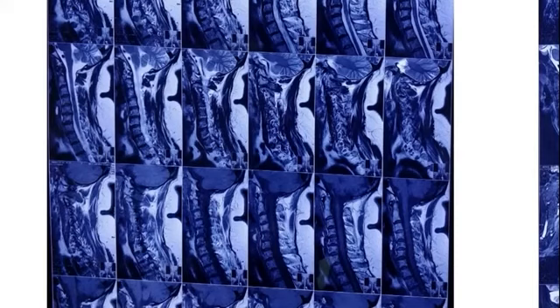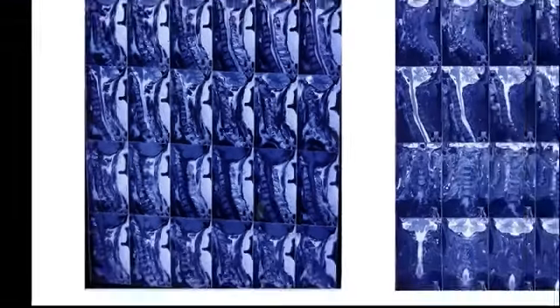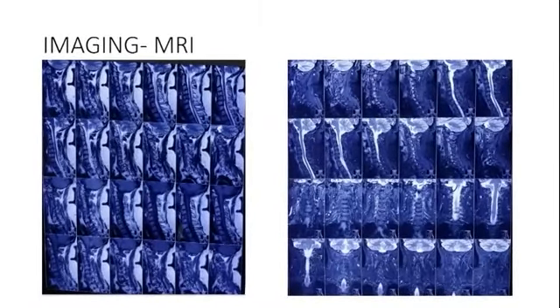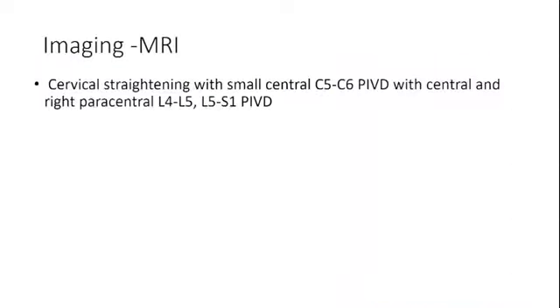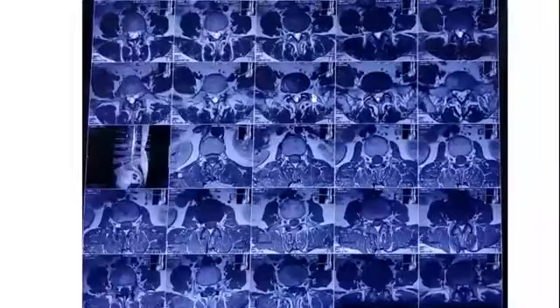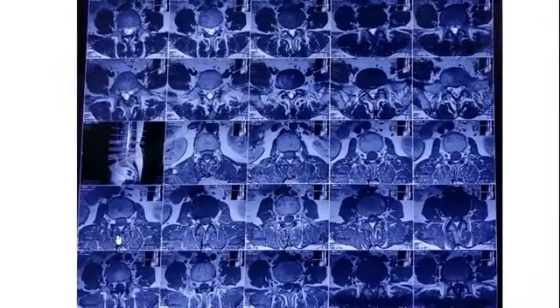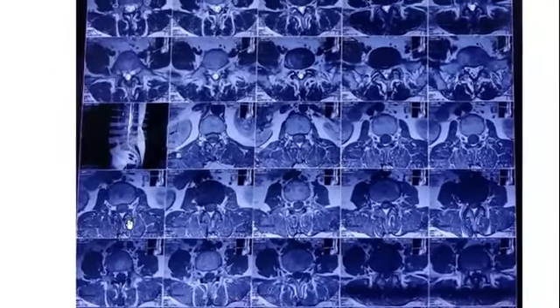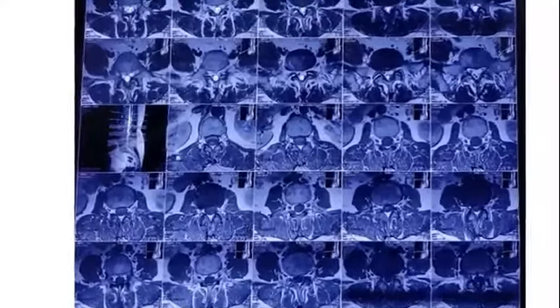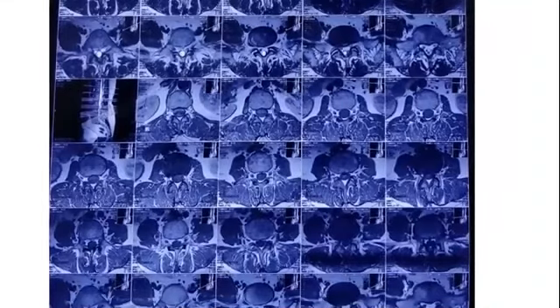Show the lumbar also. She has got a lumbar MRI, sir. Show the lumbar films, the lumbar axial. Yes, sir, I'm showing, sir. Sir, this is the lumbar MRI. She has a disc at L4-5 and L5-S1 level. So zoom out. Where is the disc? Zoom out.